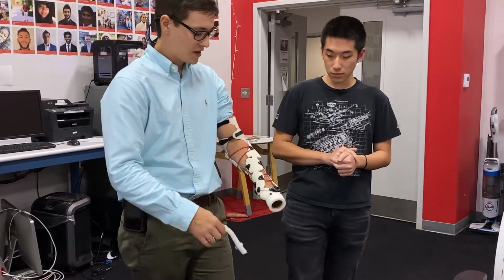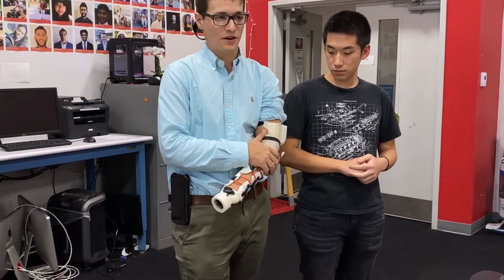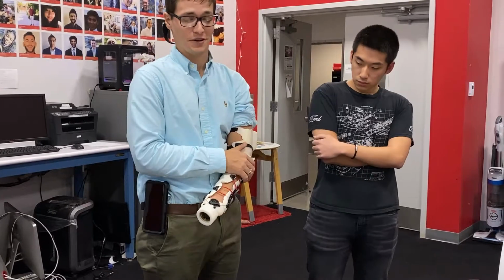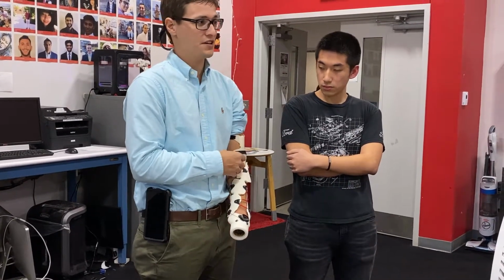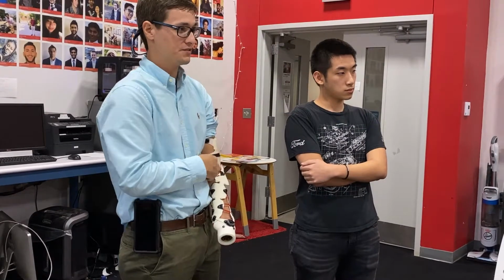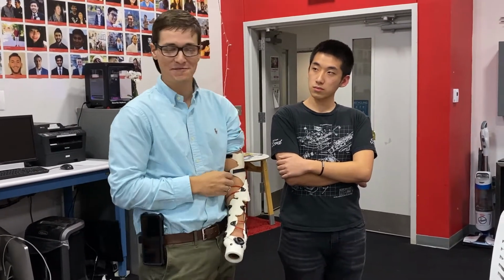Another thing is, when I started wearing devices, I was born with one hand, and I never had a prosthesis growing up. I started putting on Raptor hands, and we have to scale after, like, a couple months. Well, I grew like 15%. First it was 128, and now you're up to 152. 153. Yeah. So my arm has gotten huge compared to what it used to be.